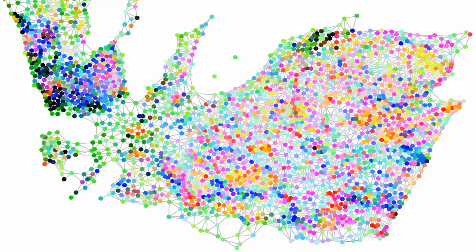Different regions have different colors, which show different types of cells or the nuclear composition, and this can be a very useful visualization tool as well in order to analyze, without zooming too much, and identify different types of patterns in whole slide images.